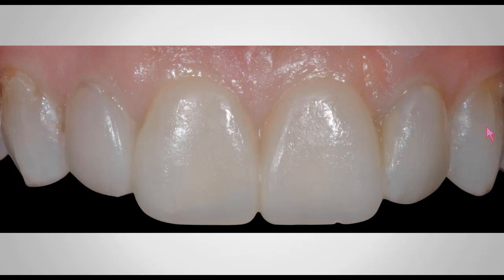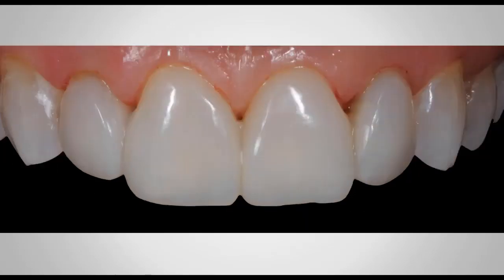You can see that the canines were not incorporated in this prototype. All I'm doing is from lateral to lateral, from 7 to 10, and you can see that I followed the actual natural facial contours that the patient presented on her natural canines. So now we can understand what an additive technique means and why in this particular case there's not a whole bunch of preparation I'm going to need to do, and these prototypes are going to serve the main purpose when I get to the preparation, which is calibration of my preparations, and I'll show you that in a minute.